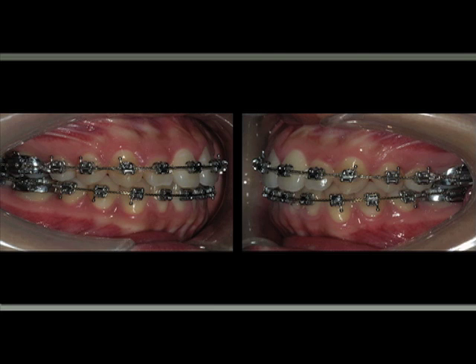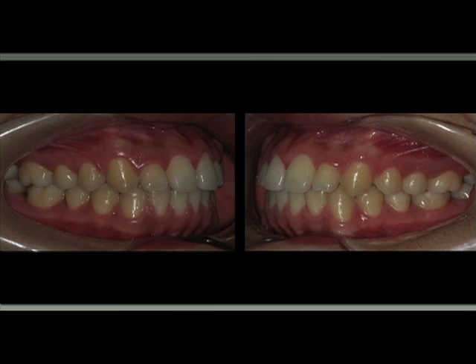As you can see in this particular case over here, what I would like to emphasize is a straight wire that goes through all the FA points where the brackets are placed, and basically the case is finished with all the crowns in the ideal position before we remove the appliances, as you can see in the next photograph.